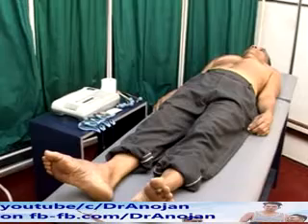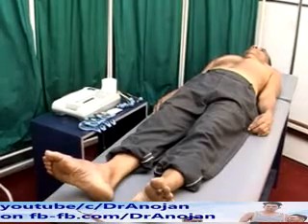In this video, we are going to demonstrate how to record an ECG.